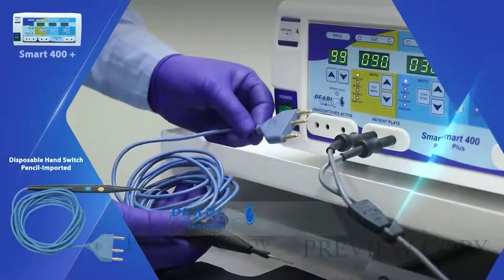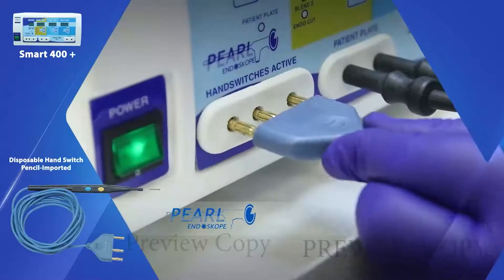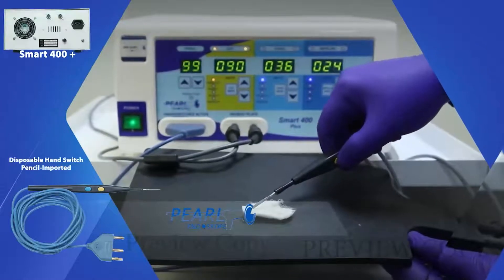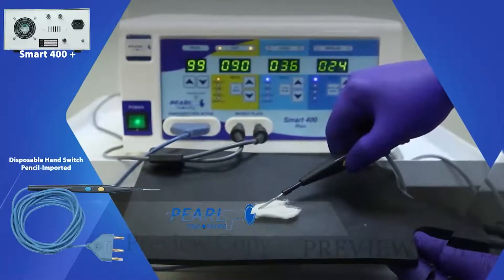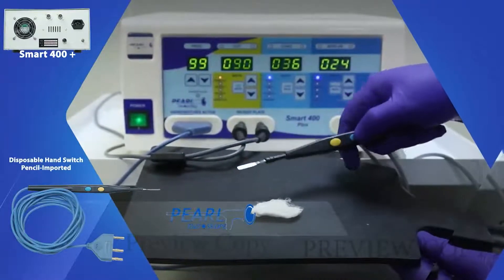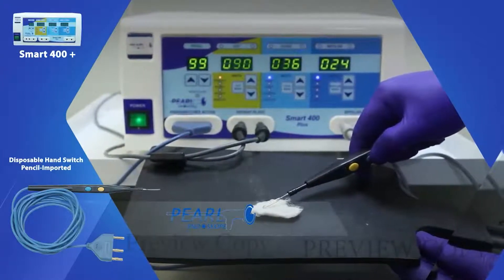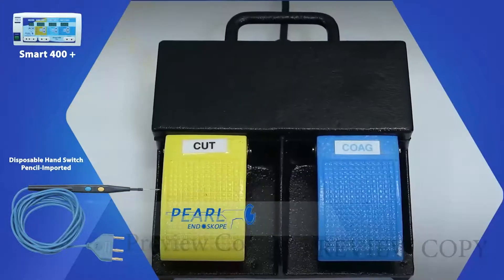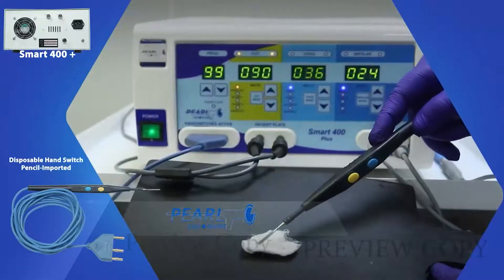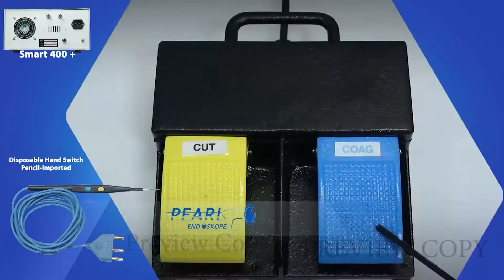This is the disposable hand switch connected to the machine. The yellow switch is for cutting and the blue switch is for coagulation. The foot switches are used according to their requirement for cutting and for coagulation.